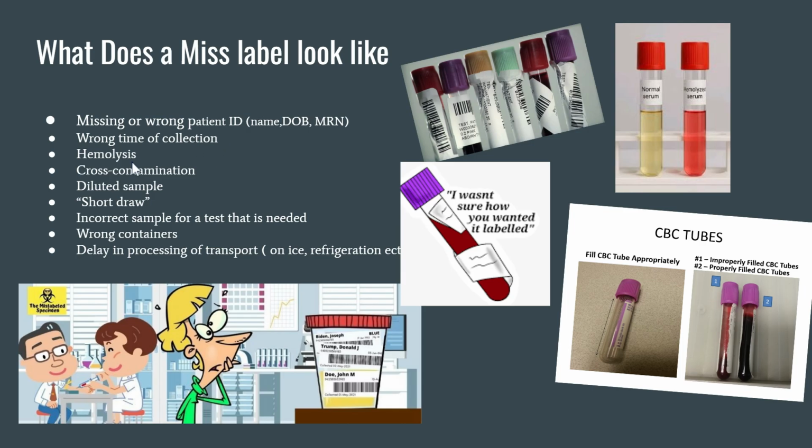And then the smallest is you won't really see it until after you have separated it and put it in the centrifuge. So like this is normal, what it should look like. And this is hemolysis after you've spun it.